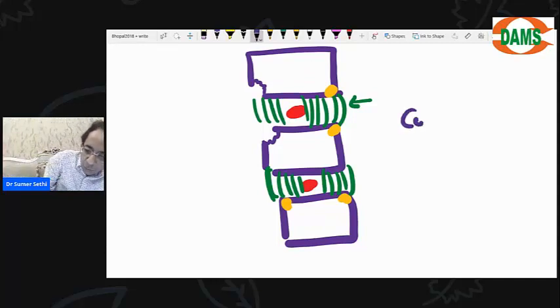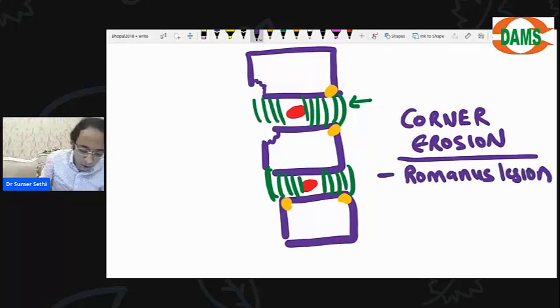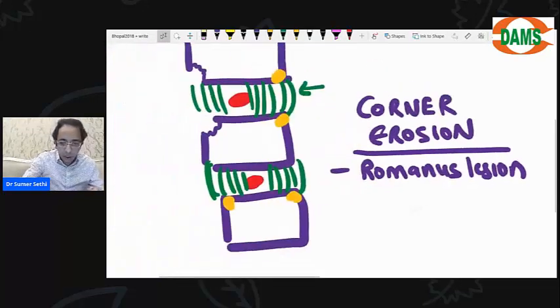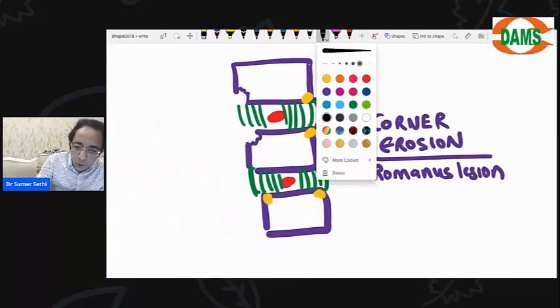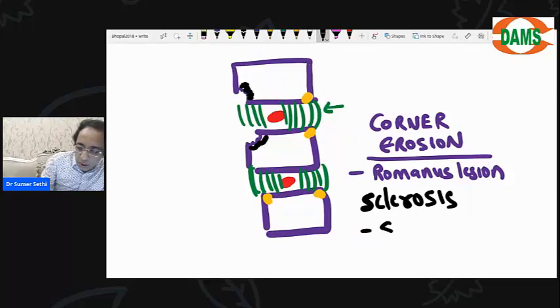So you will have vertebral corners in ankylosing spondylitis show erosions. These are called Romanus lesions. Okay. So try and understand, otherwise you will keep mugging up and this is very difficult. Are you clear? But because ankylosing spondylitis is a subacute disorder, along with erosion, you will also have sclerosis. So the corners will also have accompanying sclerosis, which is called the shiny corner sign.